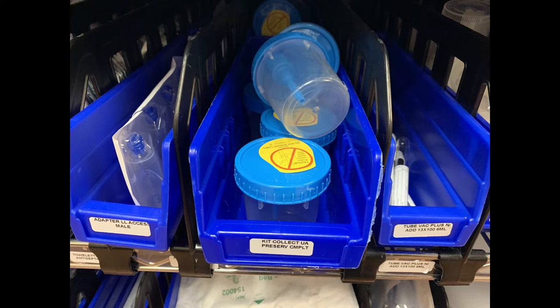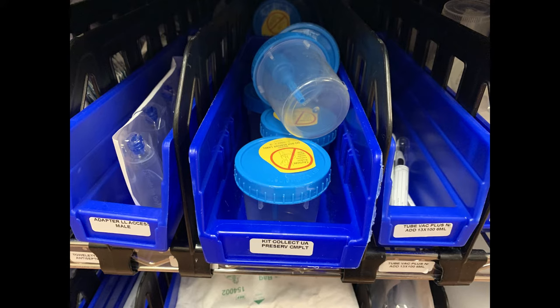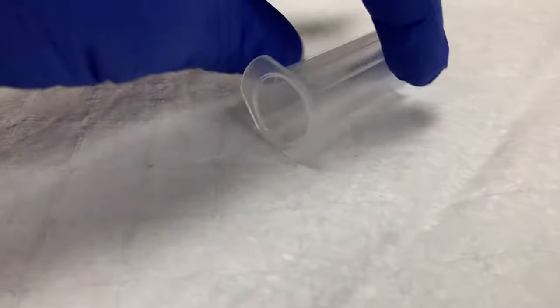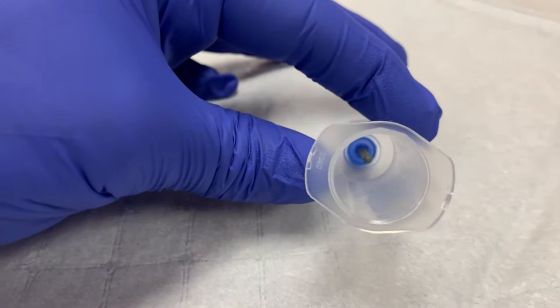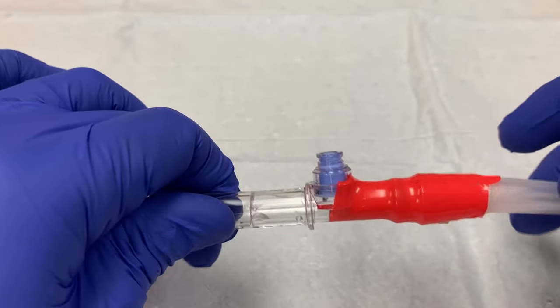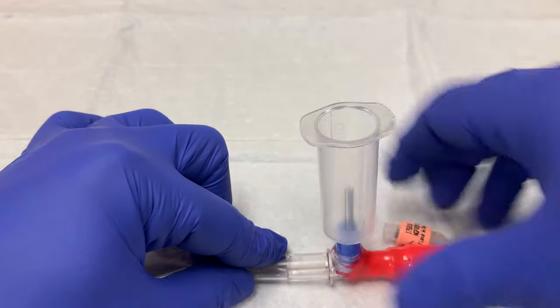These cups can be found in the pod room, usually packaged in a plastic bag with the gray and marble top tubes, but in times of supply shortage they may be separated. The white top tube should also be stored in the pod room near the specimen cup, as should the vacutainer adapter. This adapter has the same screw and port used with any standard syringe, but it is attached to a vacutainer port containing a needle in a rubber sheath, just like in the specimen cup. This port is designed to connect directly to the catheter at the port located just below the Y junction, allowing you to collect a urine sample from the tube.